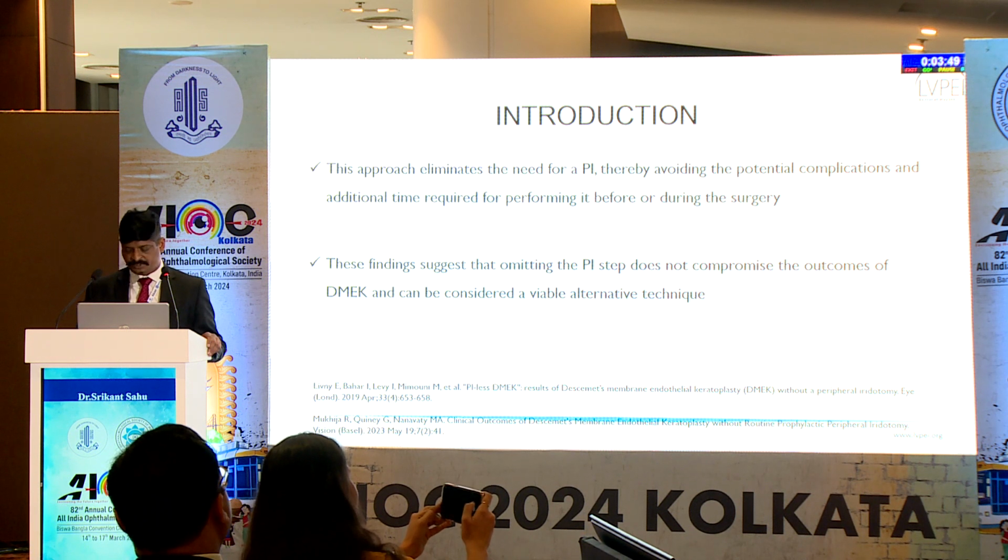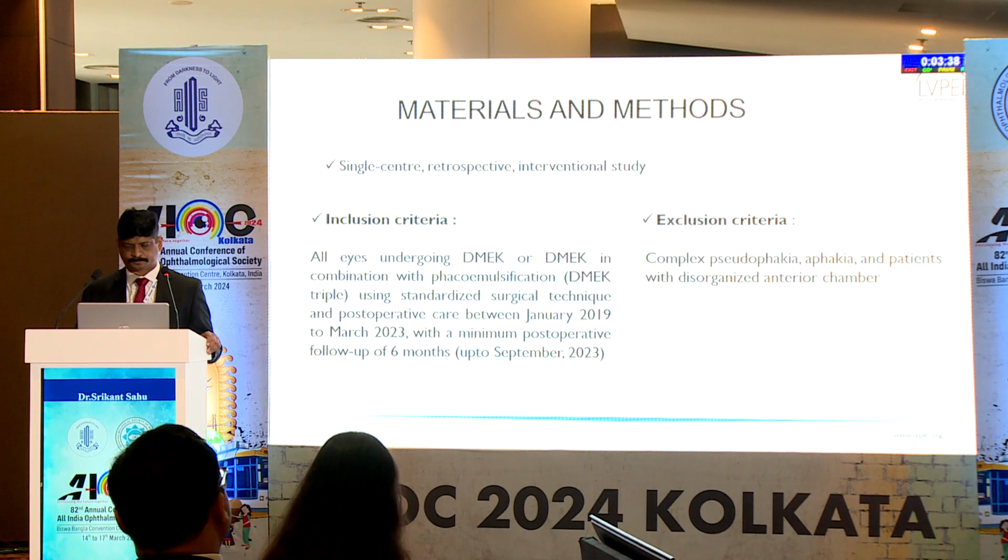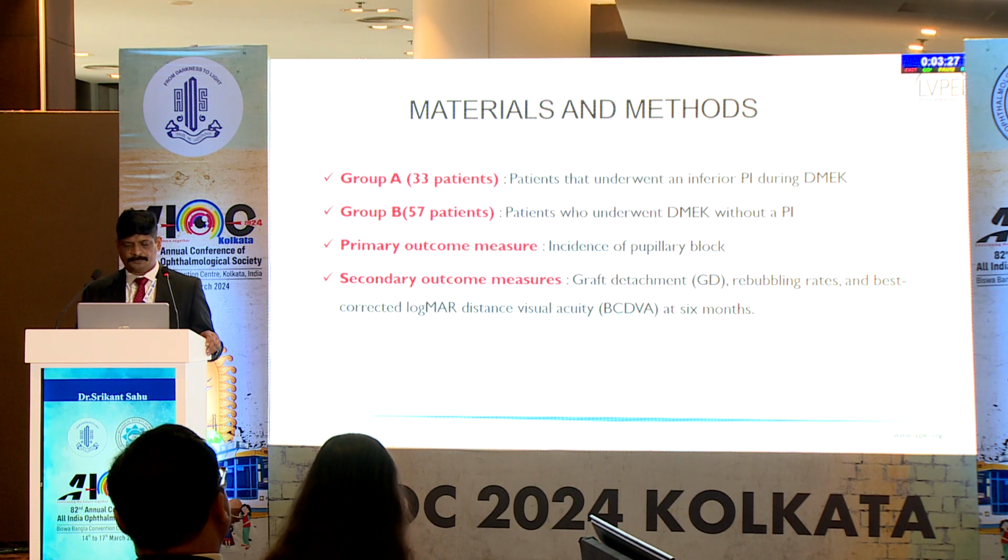without compromising the outcomes of the DMEK? So we compared the results of DMEK with and without PI, and analyzed the risks and associated benefits of both approaches. We included all patients of DMEK with or without PI from January 2019 to March 2023 with a minimum follow-up of 6 months. We had in total 90 patients, 33 of them had DMEK with PI, 57 did not have a PI.